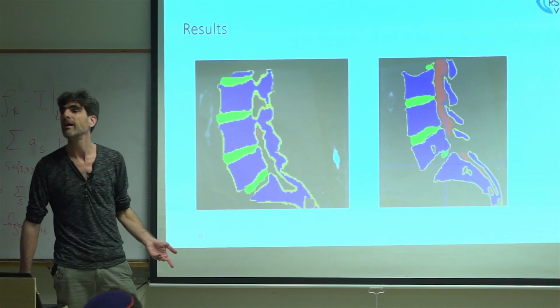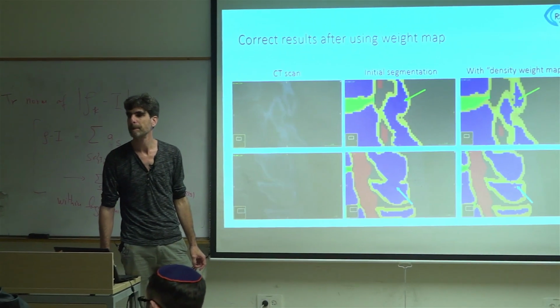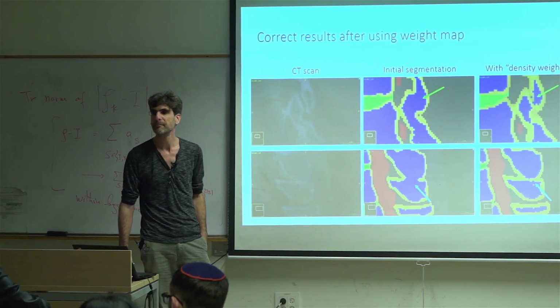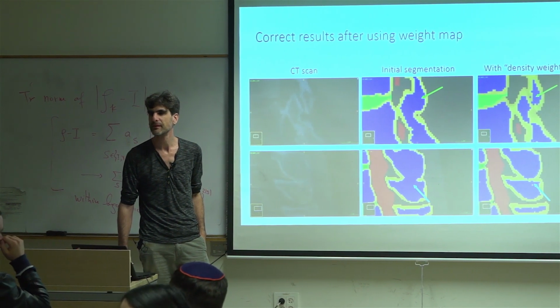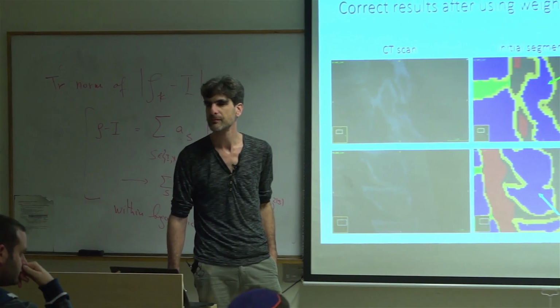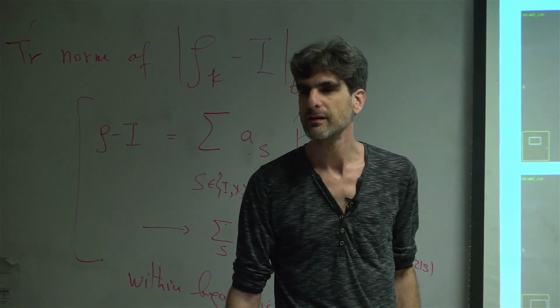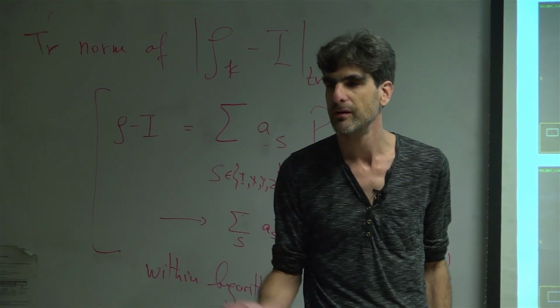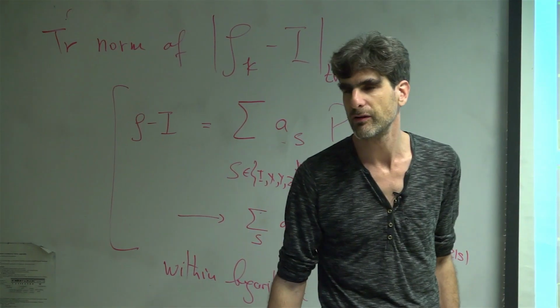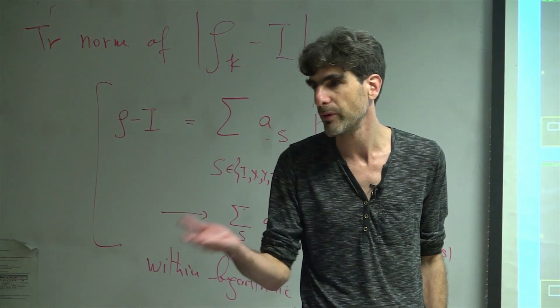Sorry, I have a question on the previous slide. When you have the regions that you want to pay more attention to, how do you do it? You take the loss function and there you augment it. Yeah, so instead of the loss function being just a sum over the voxels of the cross entropy versus the ground truth, you do a weighted sum.